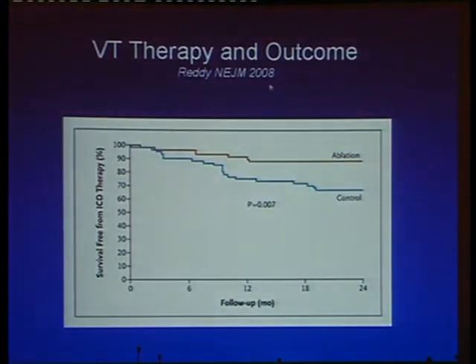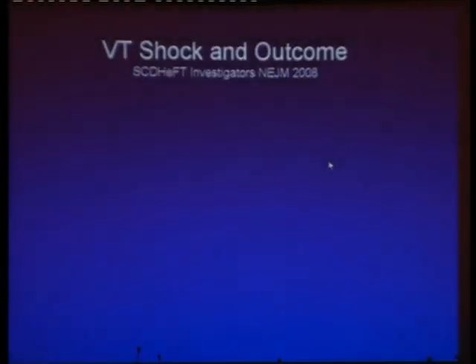So what about VT therapy and outcomes? So increasingly this focus, and I think that somebody raised a question this morning about at what point should you consider doing VT ablation in patients that have a defibrillator after 1 shock, 2 shocks or more. So in the first instance, Vivek Reddy has a New England Journal publication showing that certainly ablations can, over a period of some months up to 2 years, reduce the number of therapies from the defibrillator.